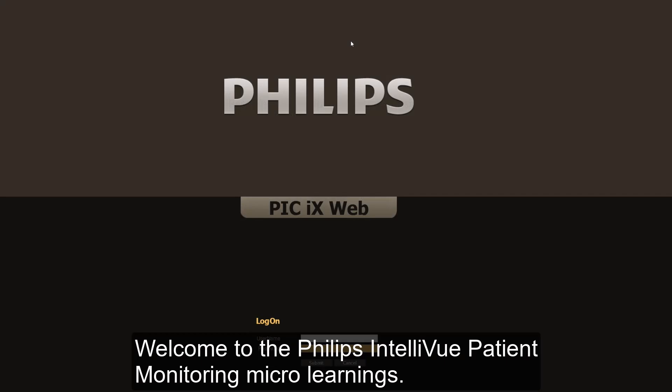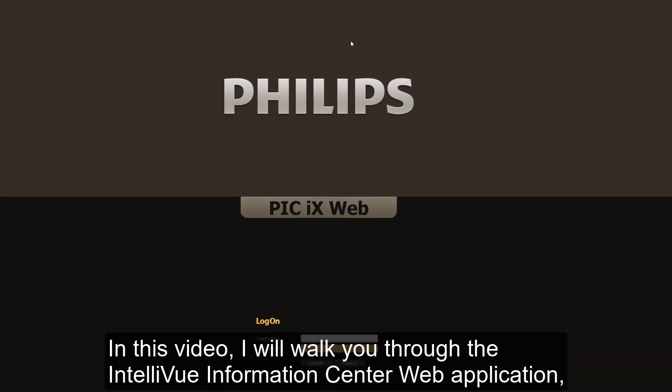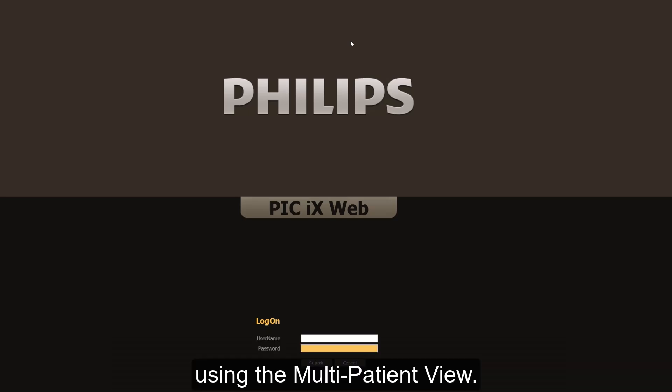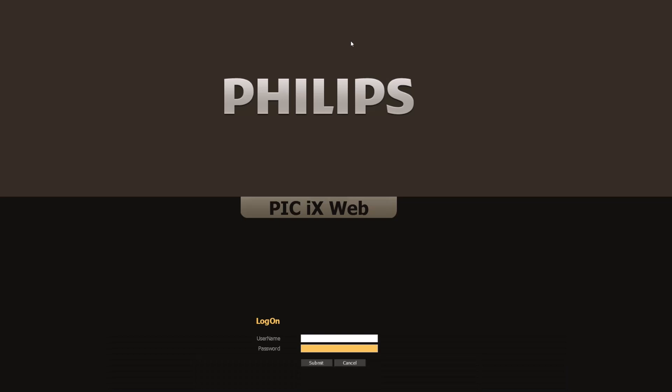Welcome to the Philips Intelliview Patient Monitoring Microlearnings. In this video, I will walk you through the Intelliview Information Center web application using the Multi Patient View. Let's get started.